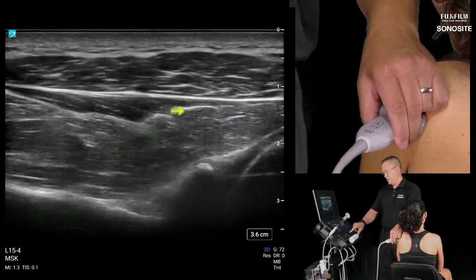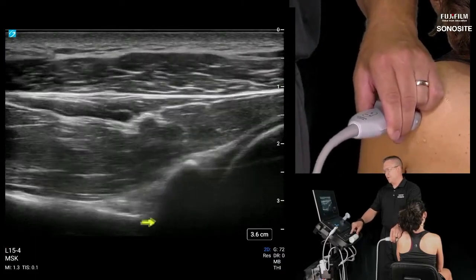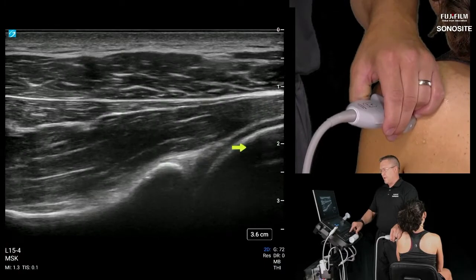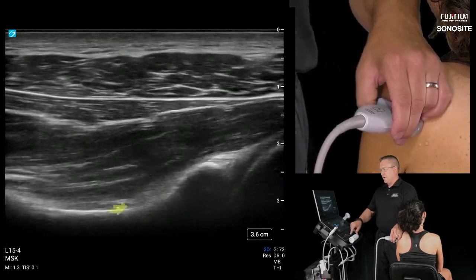And then lastly, following that glenoid tubercle, posterior glenoid tubercle, more proximally, let's look at the spinoglenoid notch, which I should have covered in the normal glenohumeral exam earlier. Here's our humeral head, posterior glenoid tubercle, and our infraspinatus fossa.